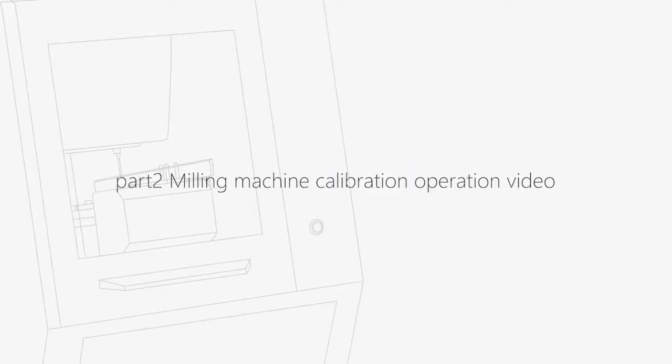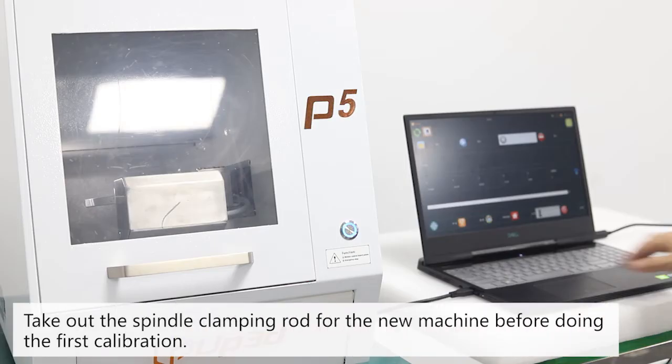Part 2: Milling machine calibration operation video. Take out the spindle clamping rod for the new machine before the first calibration.